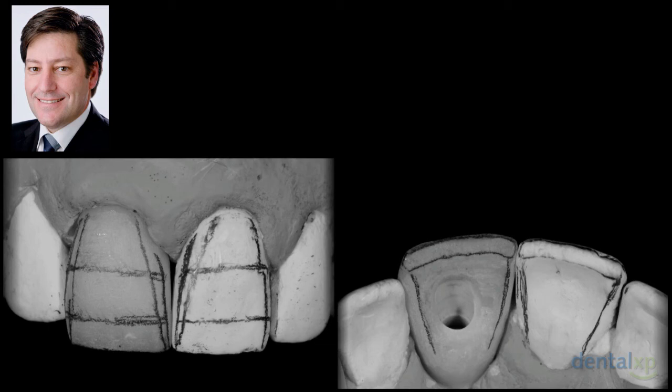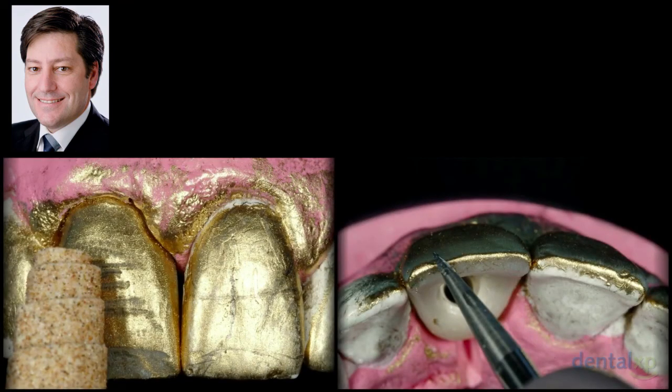This is what the eye sees. This crown is 0.3 or 0.4 millimeters wider than the other one, but you don't see it because the transition lines are placed at the same distance from each other, mimicking the contralateral tooth. Second, but not least important, is the surface texture.